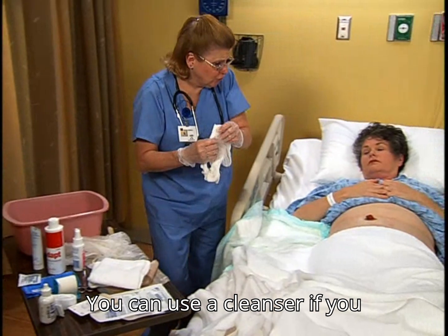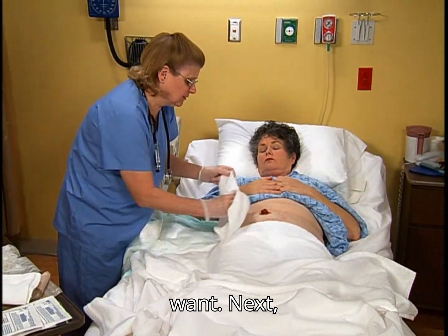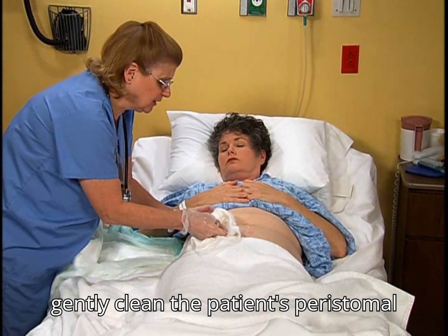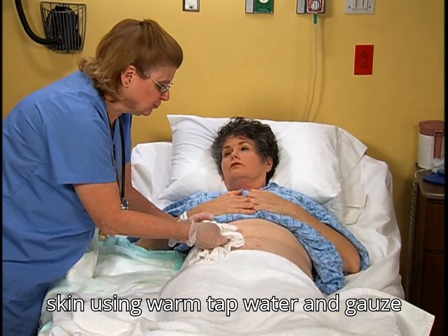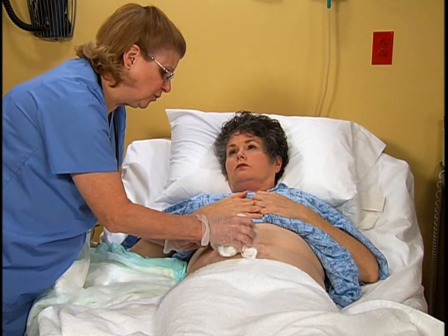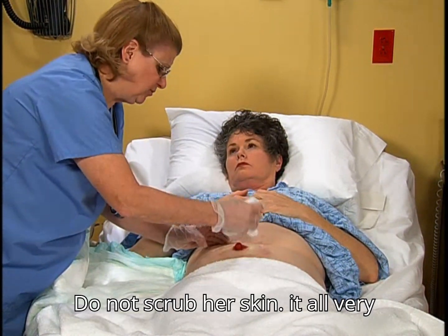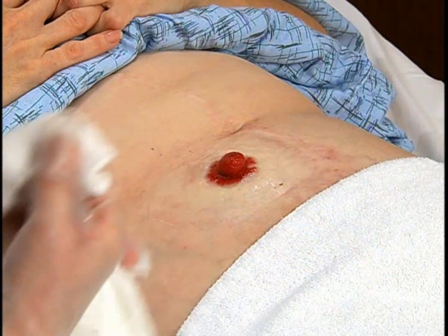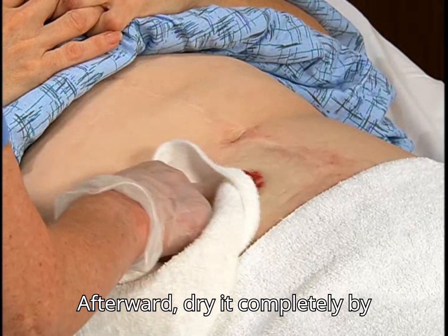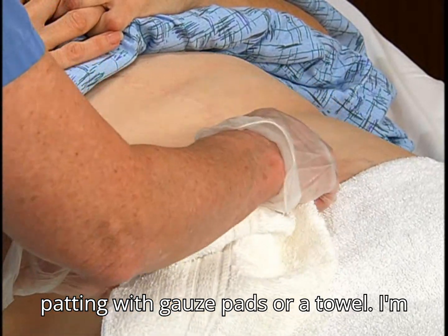You can use a cleanser if you want. Next, gently clean the patient's peristomal skin using warm tap water and gauze pads or a clean washcloth. Do not scrub her skin. Afterward, dry it completely by patting with gauze pads or a towel.